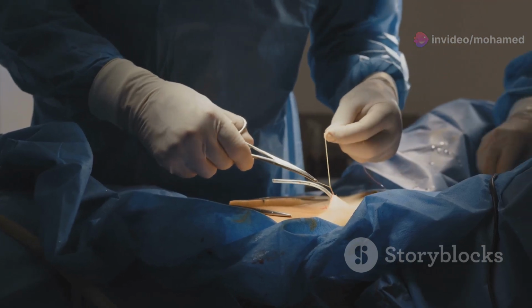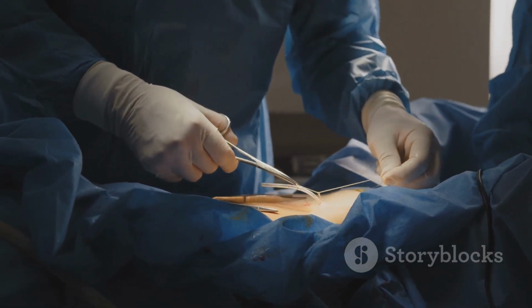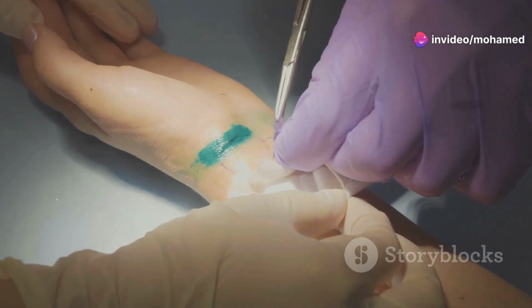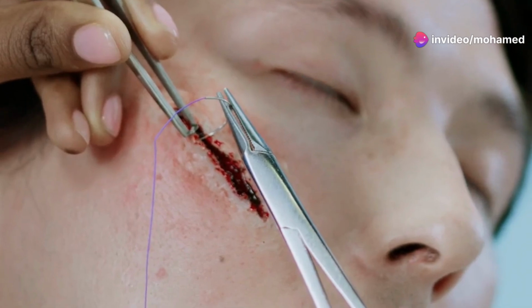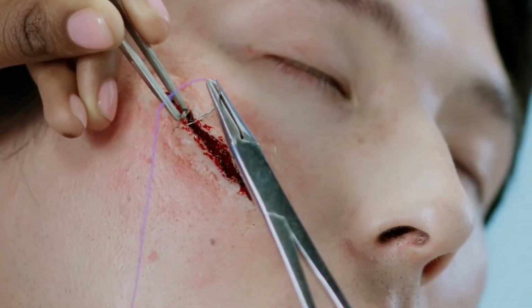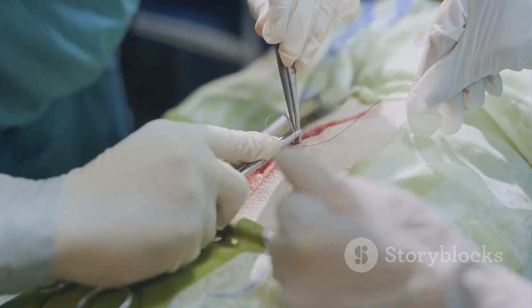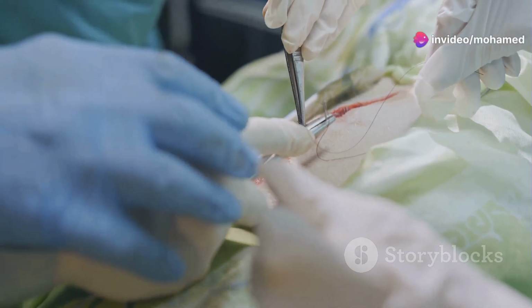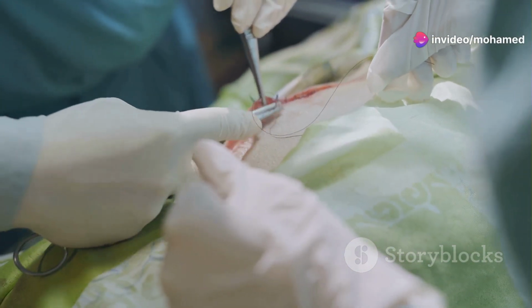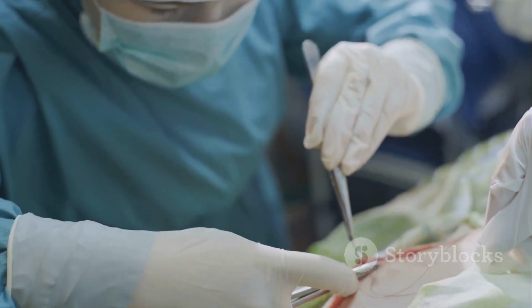Then, there are non-absorbable sutures. These are designed to provide long-term support and are used in situations where prolonged strength is necessary. These sutures are made from materials like silk, nylon, or polypropylene, and they need to be removed once the wound heals. This removal process is a critical step in ensuring the wound has healed properly. Non-absorbable sutures are typically used for skin closure, cardiovascular surgeries, and where long-term strength is needed. They provide the necessary support for tissues that undergo significant stress or movement.